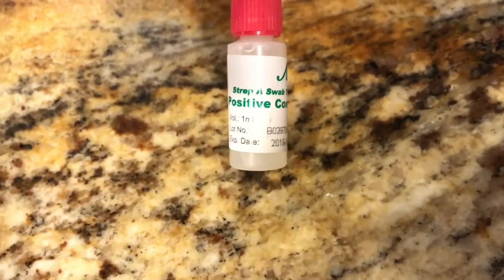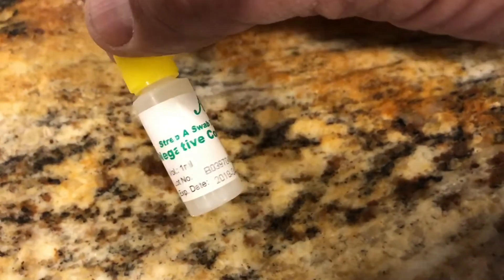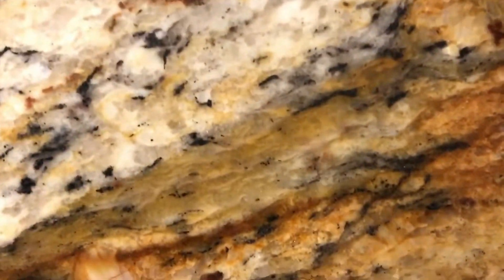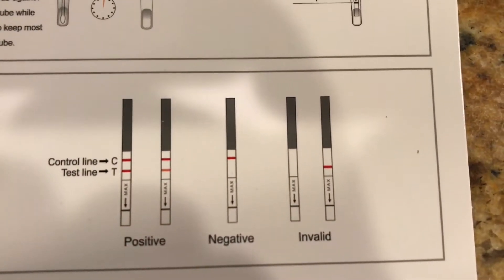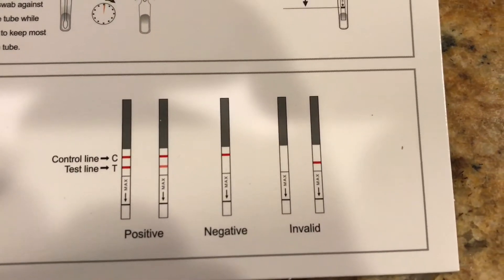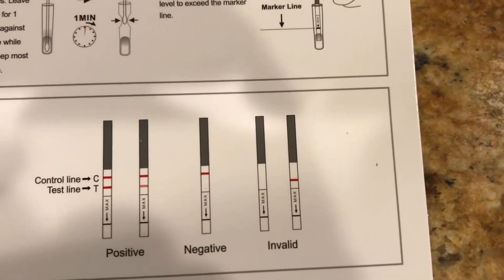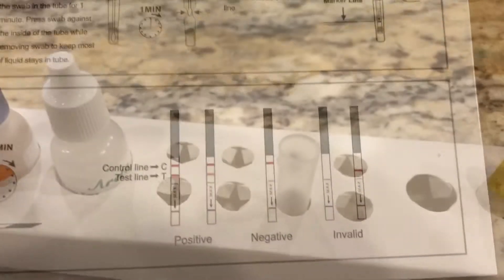They recommend that when you open a new kit you run a positive control to make sure it's working properly, and anytime you change operators. You can also run a negative control. But this is Connor's result — it is negative. One line, not two — negative, no strep. We'll see what happens when I take him to the doctor today and have them run the same strep test, so I can confirm this kit works properly.